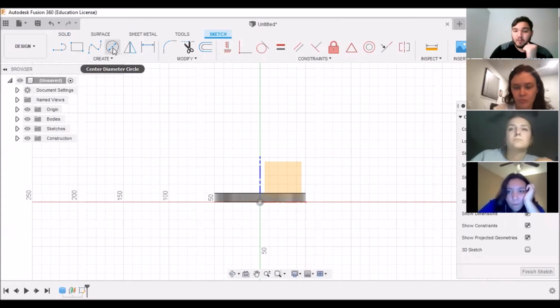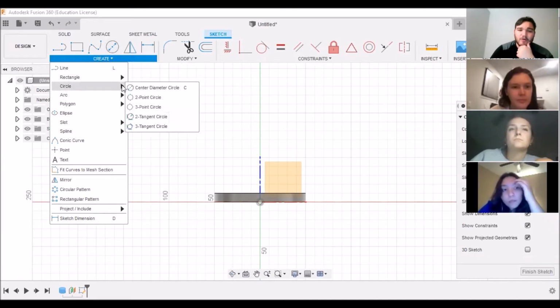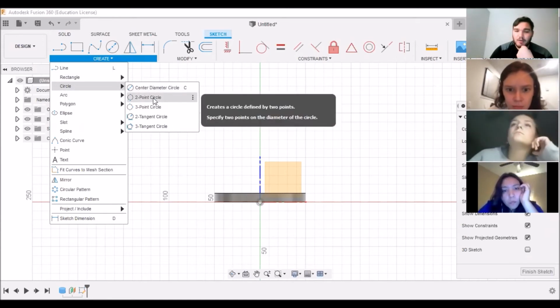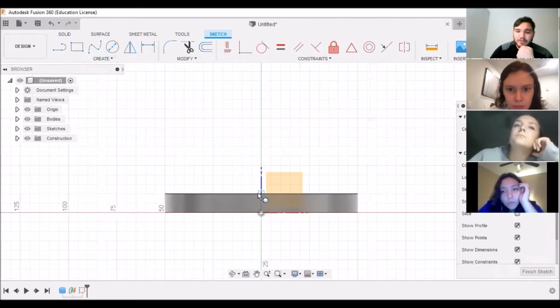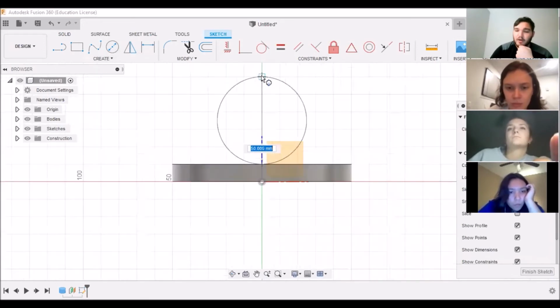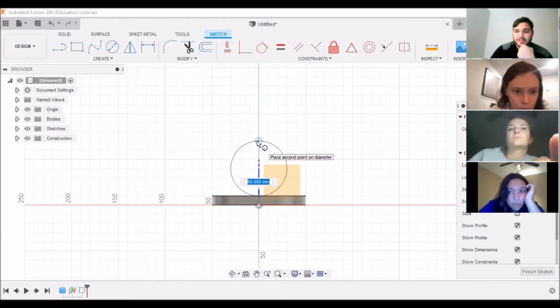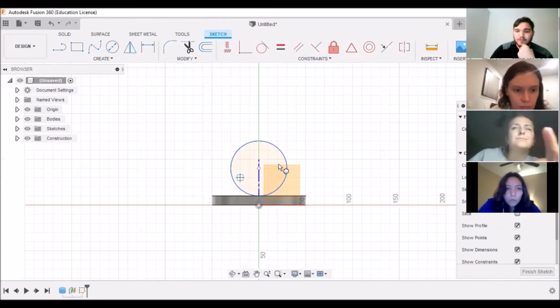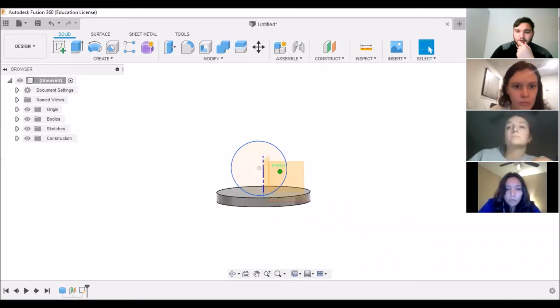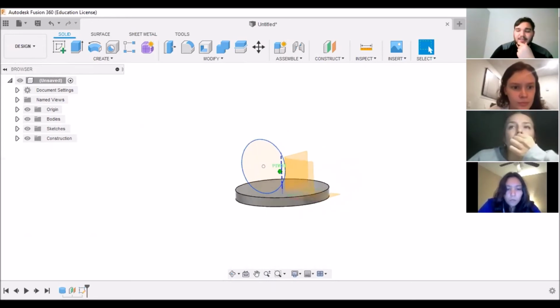So instead of the normal circle that we usually do, we can go to the Create dropdown again and see that circle has a little arrow by it. And for this case, we can actually do a 2-point circle instead of a center diameter circle. And this is more advantageous because we can zoom in right at the edge and then draw up without having to specify where our exact radius is and having to work back from there. So let's do about 60. And so once you have a circle with a diameter of 60, we can finish sketch. Rotate our cube, or rotate our body, and see that we now have a sketch that is in that same plane that we just created.